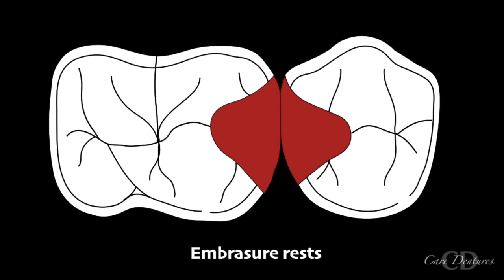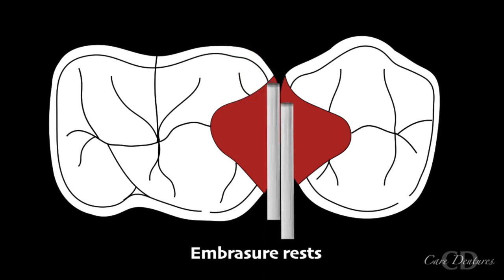Care should be taken not to break the contact between the teeth completely, which may otherwise lead to migration of tooth or food impaction. A slightly wider, tapered rounded burr is the best to achieve success in this preparation. To verify the depth, place two 18 gauge orthodontic wires within the preparation. The patient should be able to bite without any interference.